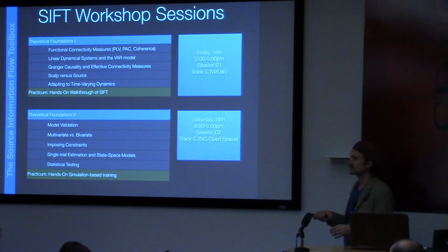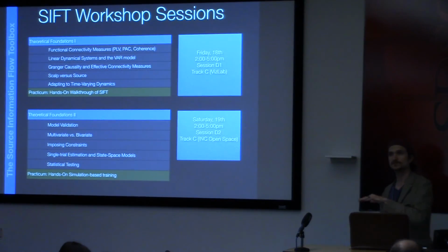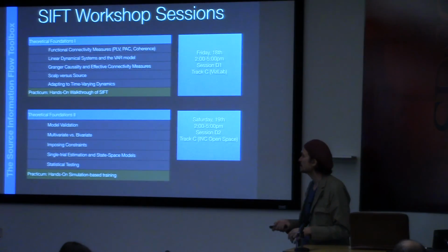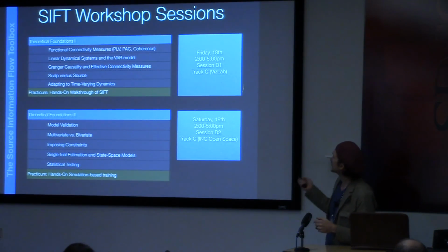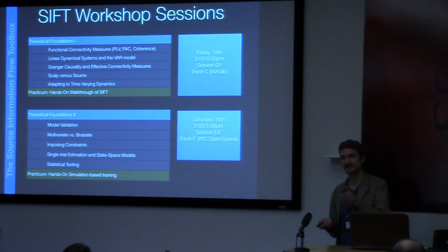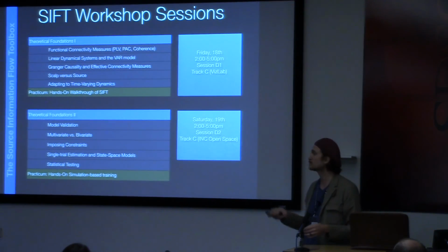We're going to have a practicum at the end on walking through SIFT, so it'll be about an hour. We're going to do some hands-on work there, and you'll get a feel for the software. So that's today, 2 to 5 p.m. in the Viz Lab. Tomorrow, we're going to move on to more advanced topics, the second set of theoretical foundations.